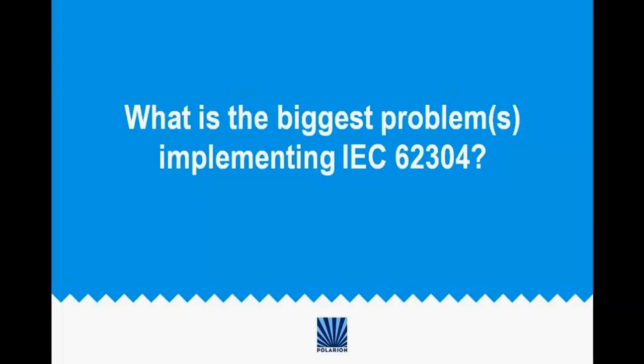Mm-hmm. Another major issue that I see around implementing is legacy issues. It isn't like entire organizations stop everything that they're doing and then cut over. Usually there's some degree of parallel processes running, or aspects of 62304 that are somehow folded into the existing processes. So figuring out how to retrofit or bolt on 62304 in some appropriate manner into an existing quality system and software development lifecycle, in a way that is coherent and trainable and explainable and defendable, can be a particular challenge.